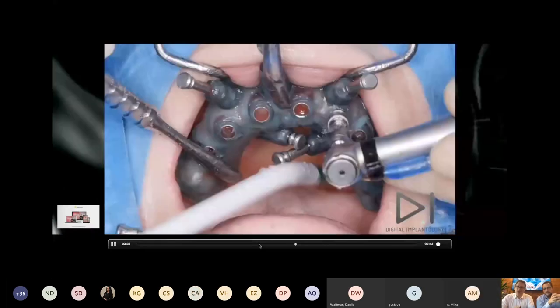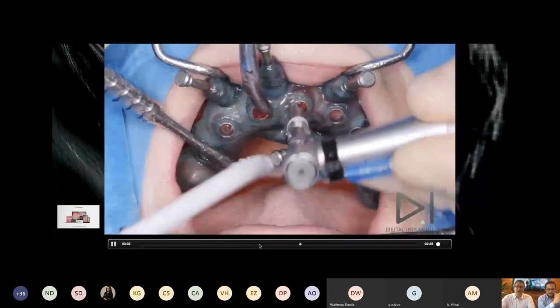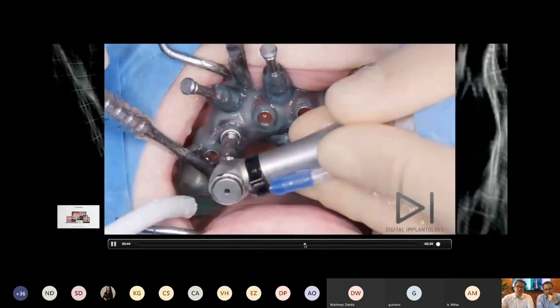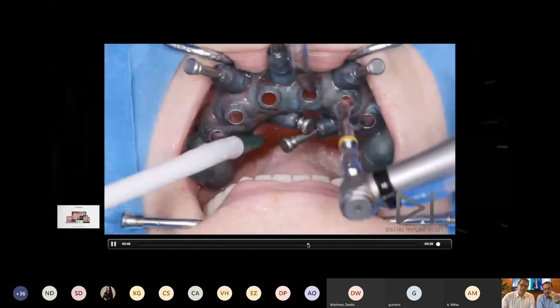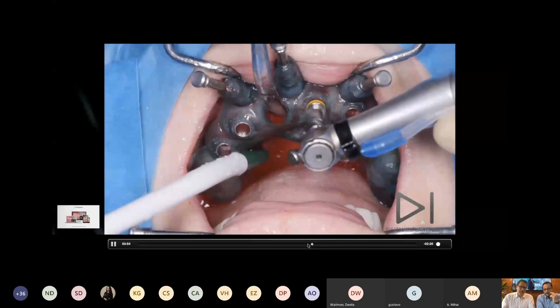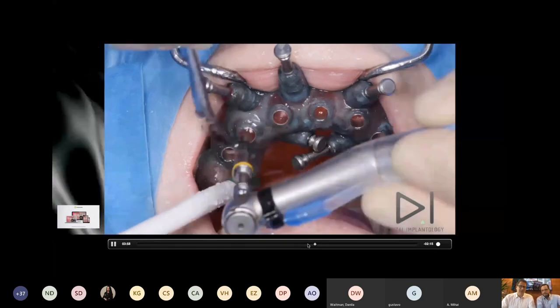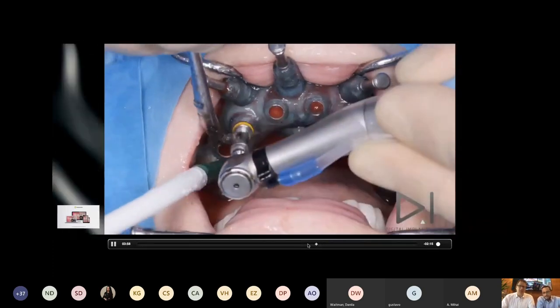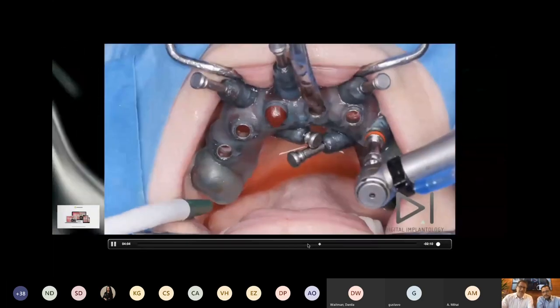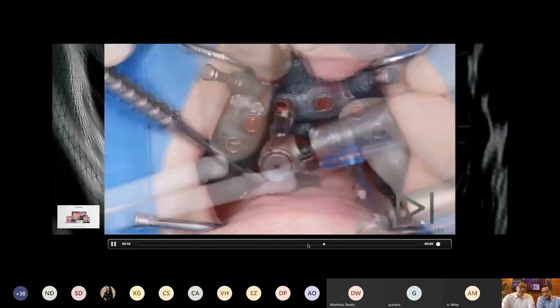And look, the drill goes very fast. It's the first drill, 2 millimeters, it goes very, very easily in the bone. And we can under-prepare. This is a 2.4, and we can use the implant like an osteotome to compress the bone and to increase the stability, because we know with our implant, we can change the quality of the bone with our surgical steps. 2.8, fast, this is live. Look, this step is live, without any cuts, okay?